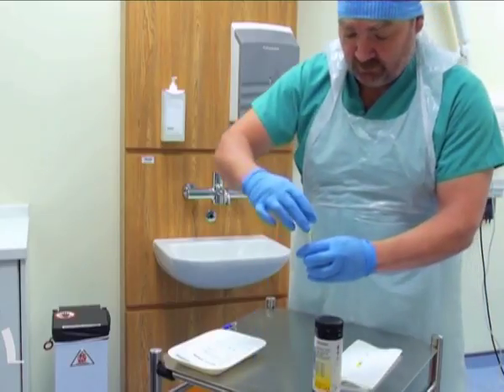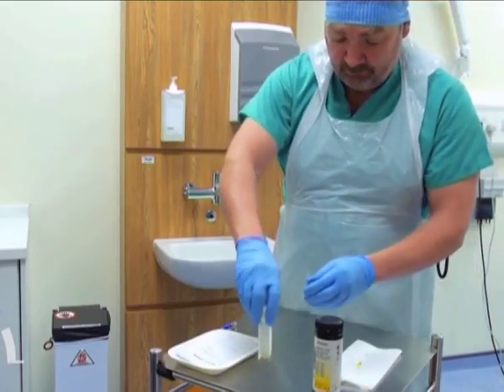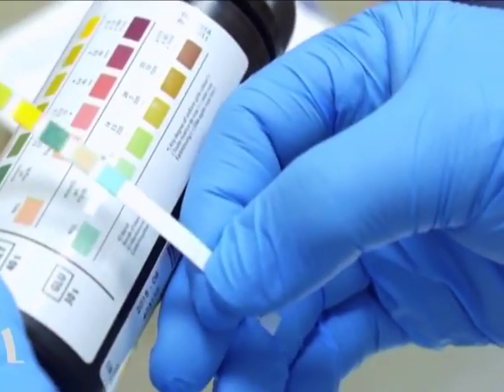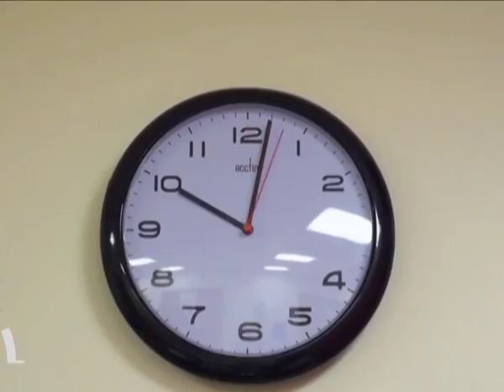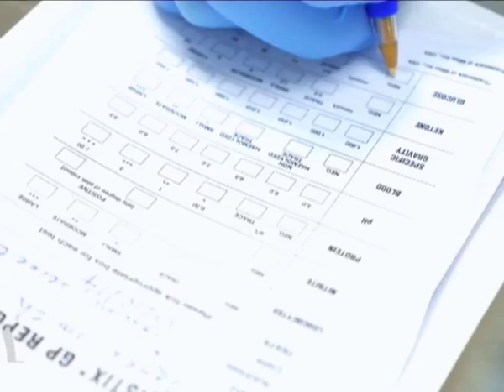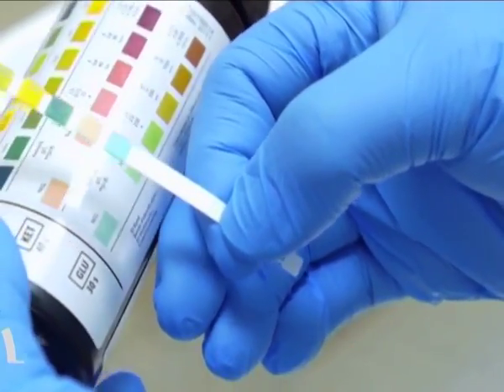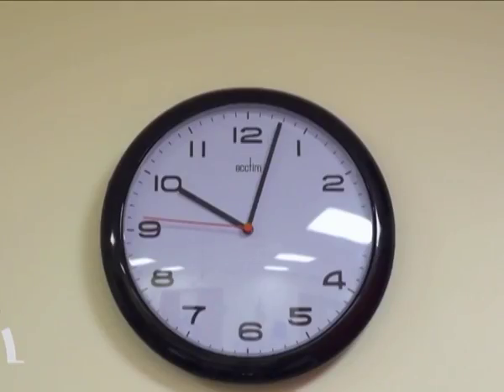test. To reduce the timing errors and eliminate variation in color interpretation, automated instruments are frequently used to read the results of the test strip. The degree of color change on a test pad can give an estimate of the amount of substance present. For example, a slight color change in the test pad for protein may indicate a small amount of protein present in the urine, whereas a deep color change may indicate a large amount.